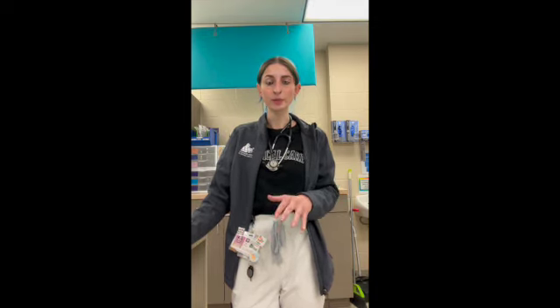Industrial autoclave. So I just came back upstairs just to further talk about how to properly set the autoclave, just because it is very loud downstairs. Small wound pack specifically, we're going to set that at around 250 degrees Fahrenheit, and then we're going to set that pack in there for around 30 minutes, and it's going to reach about 15 psi.